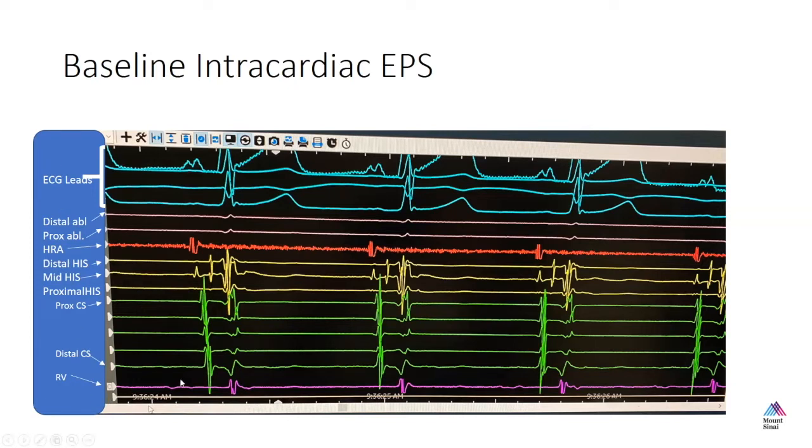And then finally, there's a signal in the right ventricle. As you would expect, the right ventricular signal is the latest of all of the ventricular electrograms because it takes the longest to go from the atrium down to the distal apical right ventricle. And so we see here in the proximal CS and in all the CS pairs, we have an atrial electrogram and a ventricular electrogram because the catheter is sitting on the AV valve annulus, nicely poised between atrium and ventricle. Okay, so any questions about that?